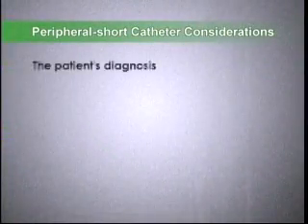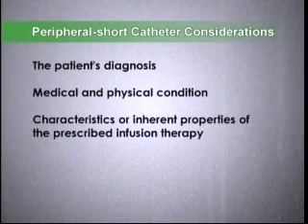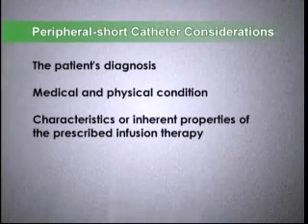Peripheral short catheters are introduced into vascular structures for specific diagnostic reasons. Use of these devices is based on several considerations, including but not limited to the patient's diagnosis, medical and physical condition, and characteristics or inherent properties of the prescribed infusion therapy.